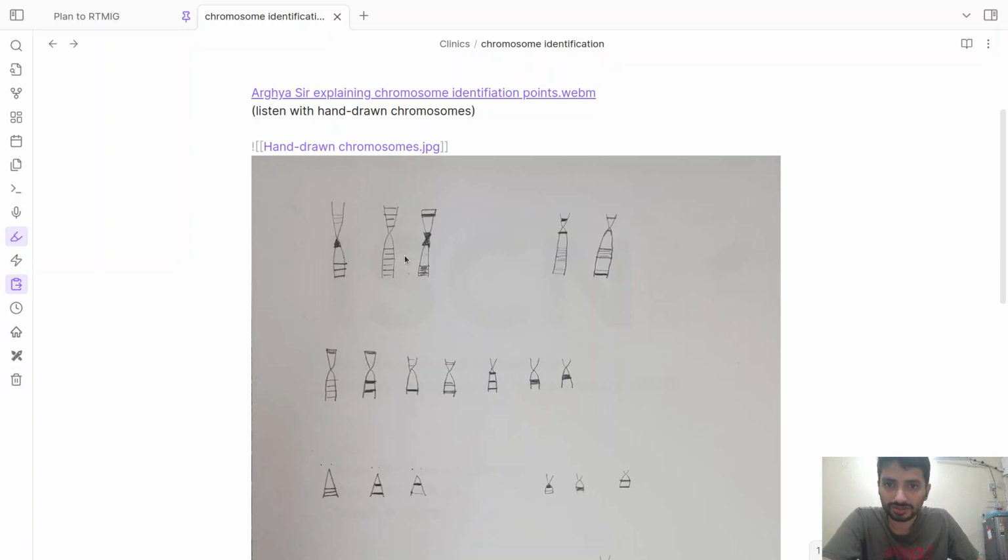And chromosome 2 actually does not have very good staining in the centromeric region, which gives it away. And chromosome 3 is actually the opposite. It has very dark staining on the centromere and very light staining on either arms, except for the distal portions. So what is quite characteristic of the first three chromosomes is that they are extremely large. So you will not miss them on a karyotype. They will stand out from the rest of the chromosomes, and that is what will give them away.